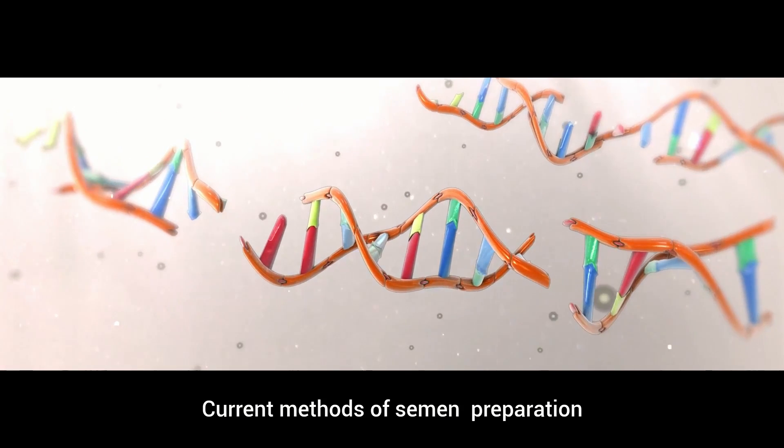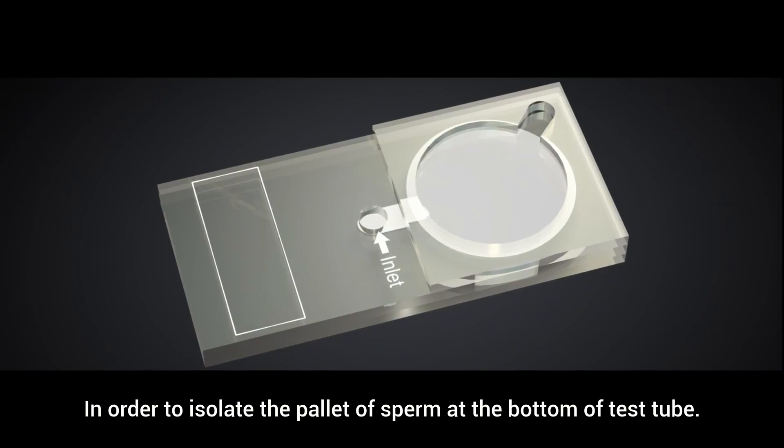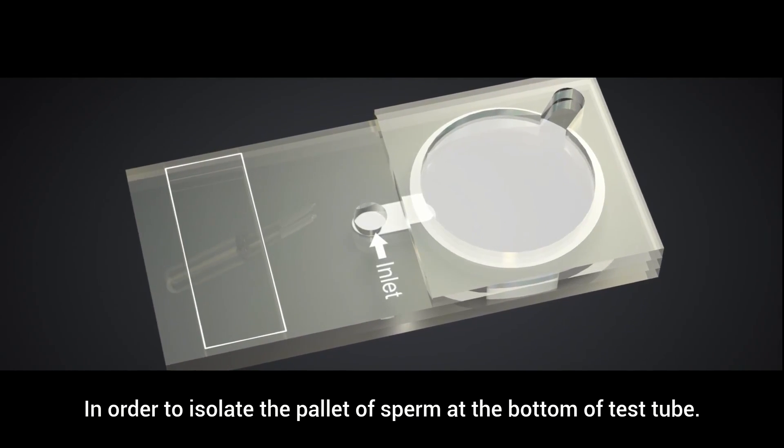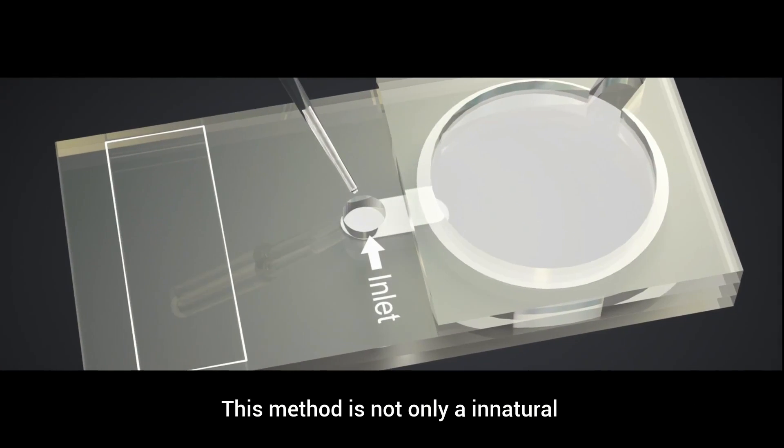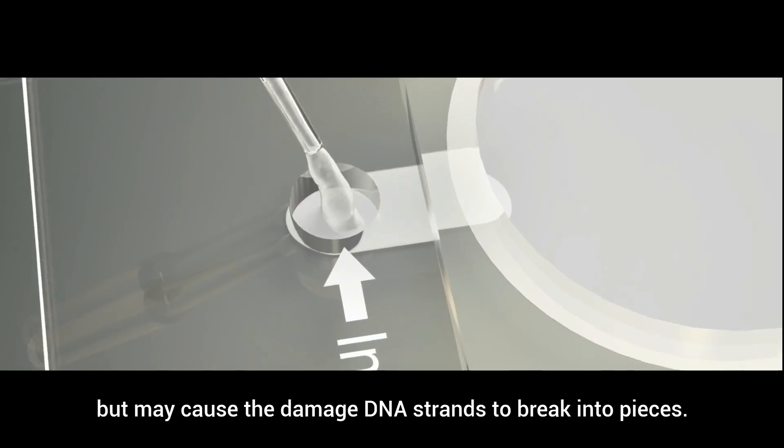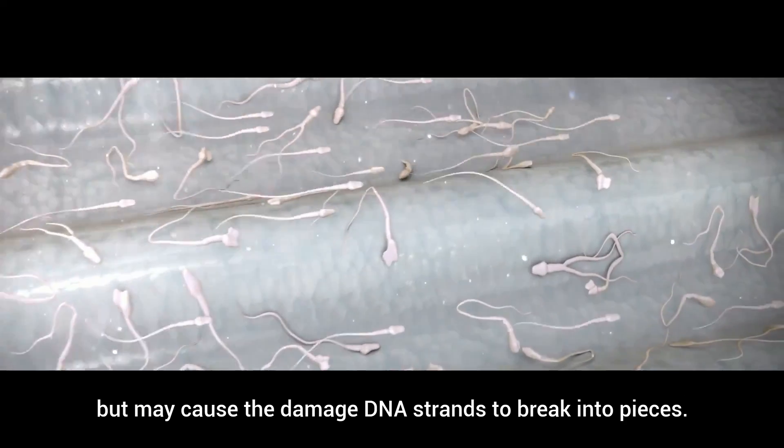Current methods of semen preparation involve high-speed centrifugation of semen in order to isolate the pellet of sperm at the bottom of a test tube. This method is not only unnatural, but may cause the delicate DNA strands to break into pieces.